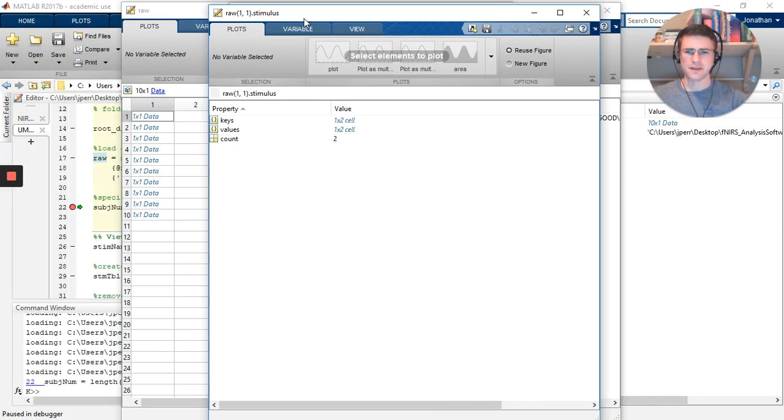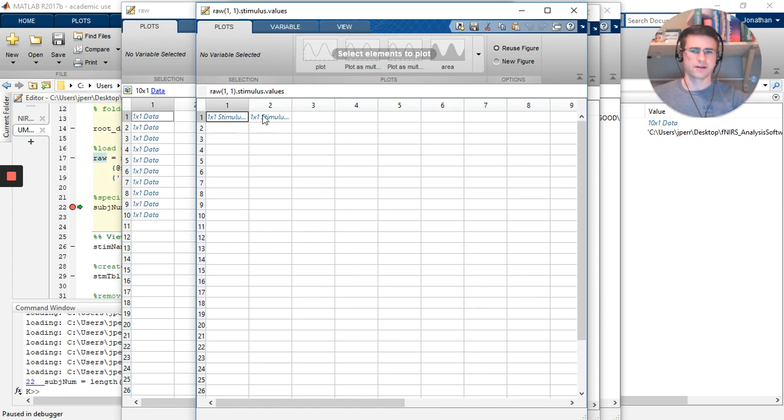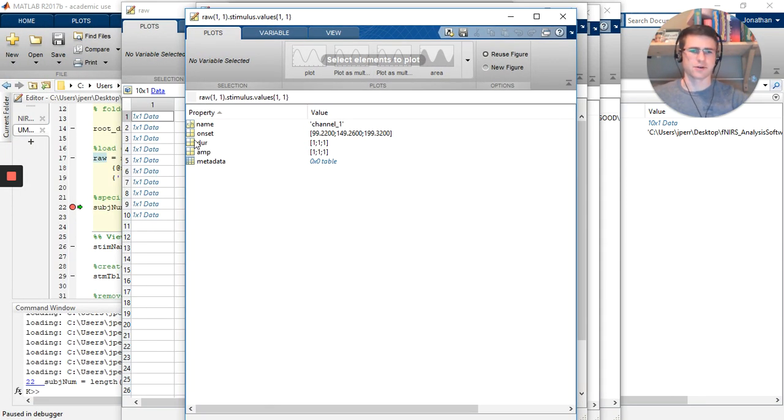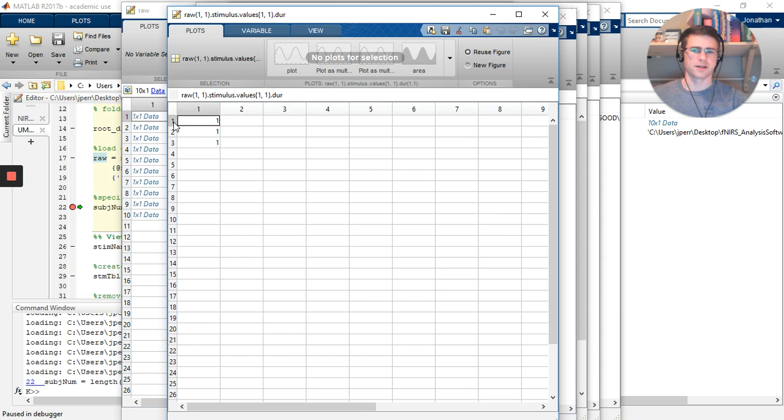If I open that up, this subvariable has keys, values, and a count. I have two event types. If I open up values, the values are in the format of one row per the number of conditions for columns. The duration is saved under the DUR variable. The format of this is one column by the number of occurrences of that stimulus type.